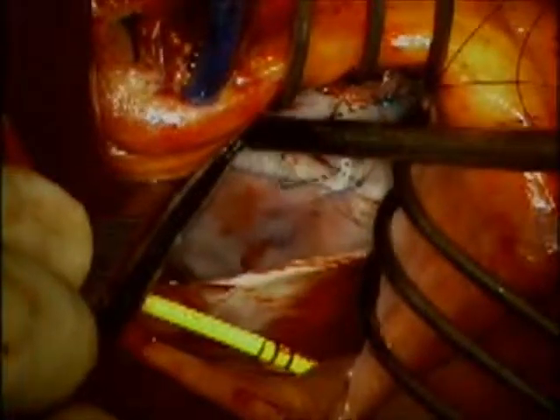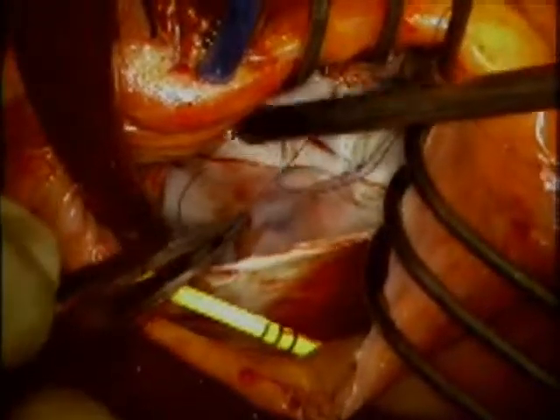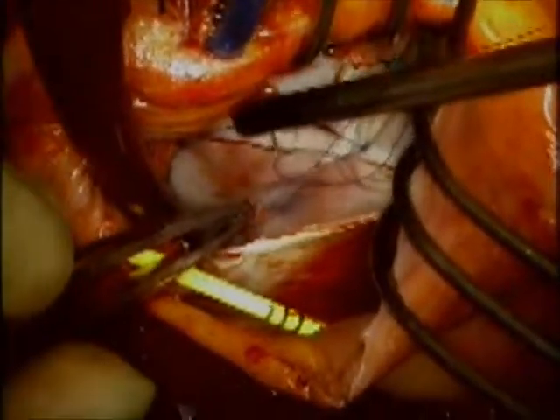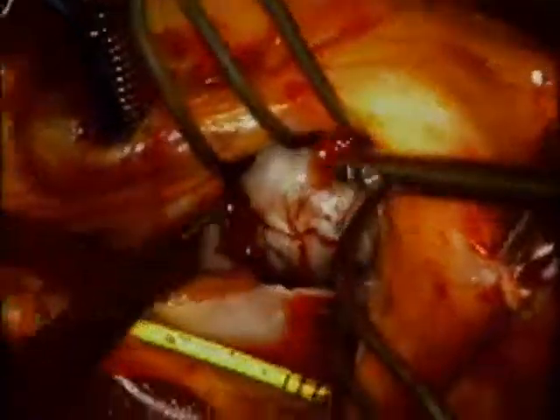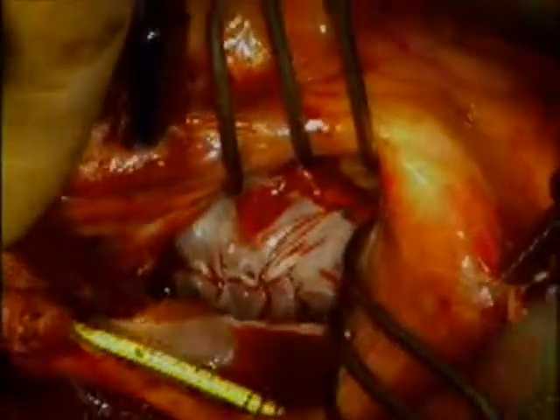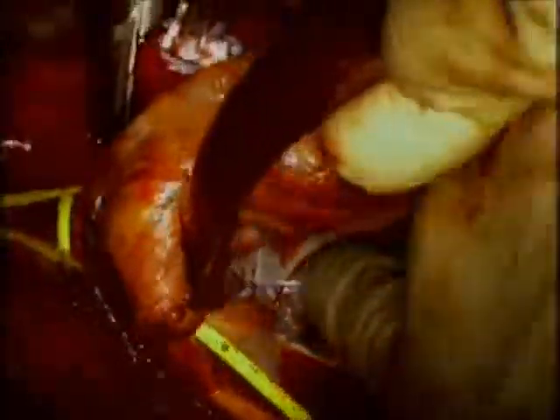The echocardiographic images at the end of surgery will show you the before and after in terms of atrioplasty and volume reduction for the left atrium. Here you can see the completed suture line, which is tied in place.